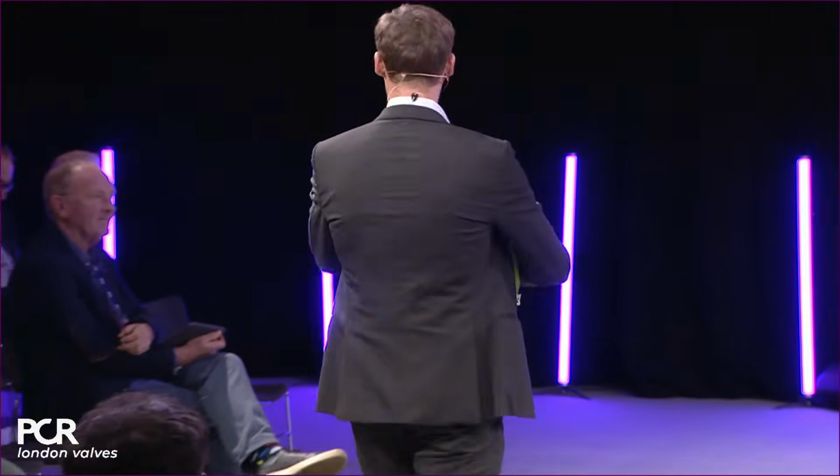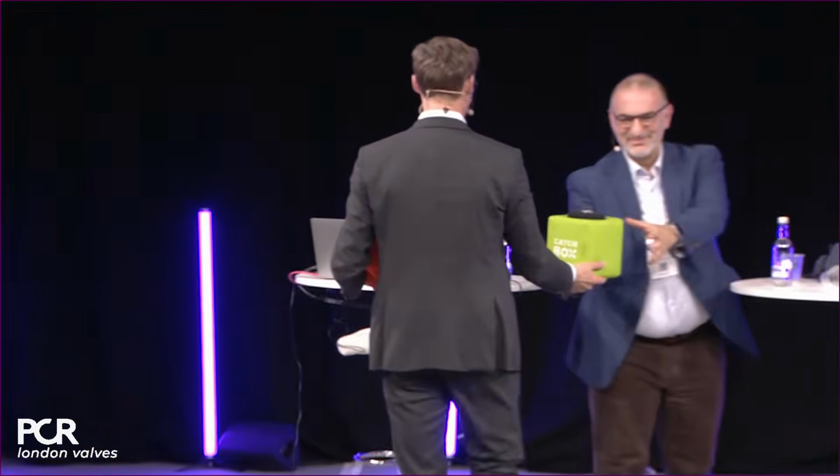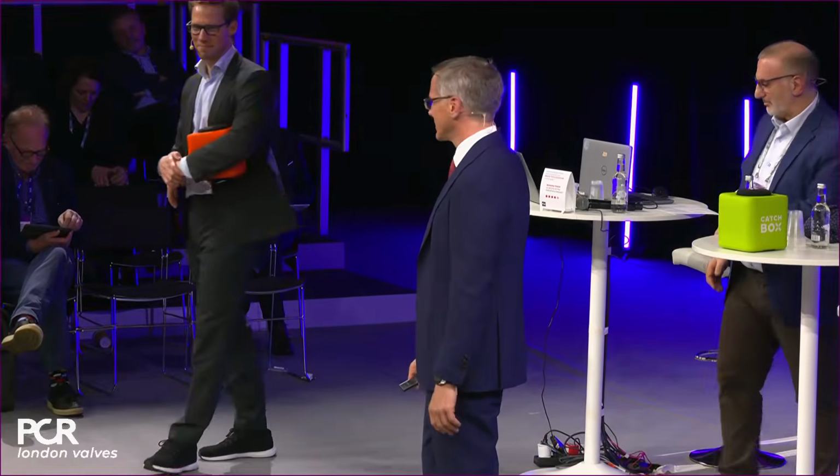Okay, so you would do an extra pre-dilation with a non-compliant balloon. Yeah, maybe a 23 balloon would be sufficient. But I saw that you didn't use a Safari or Confida, right? No, that's correct. It's a Lunderquist wire. Okay. So you and Stan are sticking together, huh? Yes, it just was gut feeling. I heard all the talks from the US, but nevertheless, with this bicuspid anatomy and huge anatomy, I wasn't able to give up the Lunderquist.